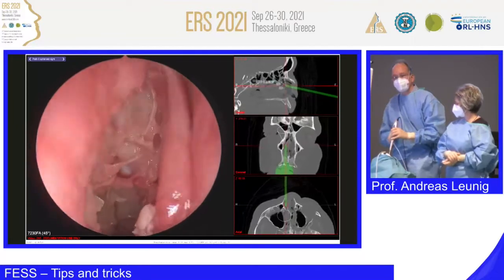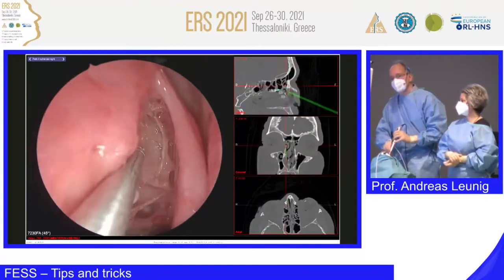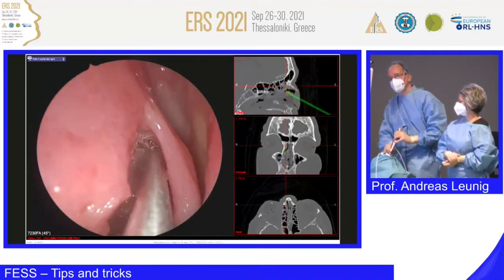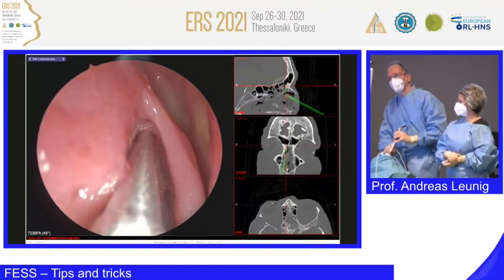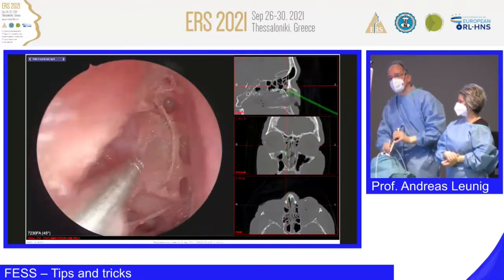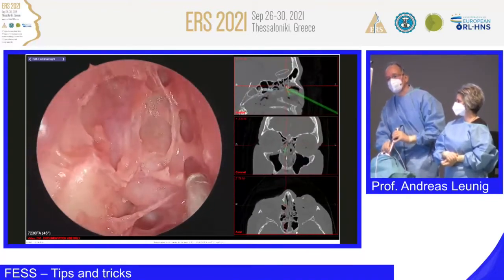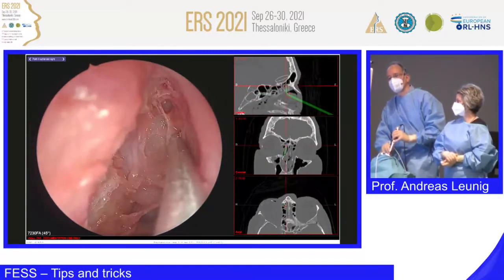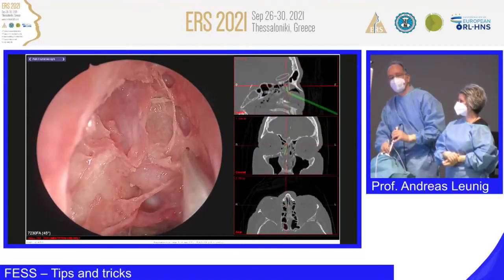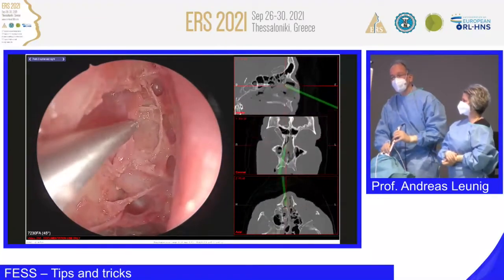So, you can adapt this kind of pointer, which is very nice. It's for the electromagnetic system, and when we go up here, I think we are slowly approaching the frontal sinus, and maybe, or not, there seems to be some bony lamella up there. I don't know. Have a look up there. Where is the entrance? What do you think? Do you think here? This way? Okay, so you see, it's not easy, because it can be complicated. What do you think? Where to go?